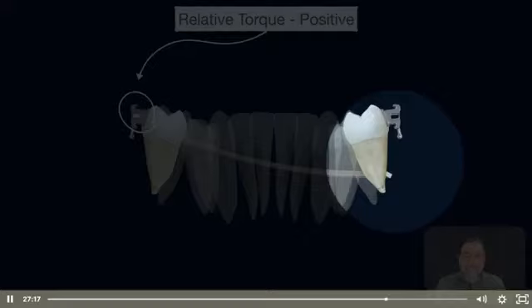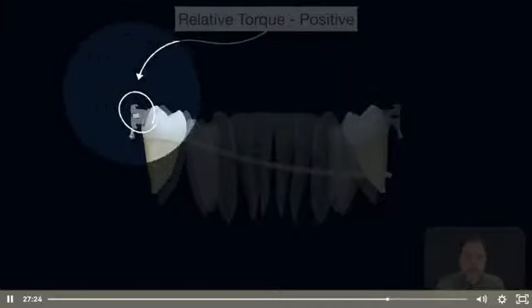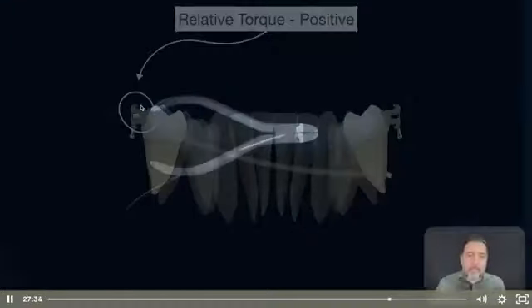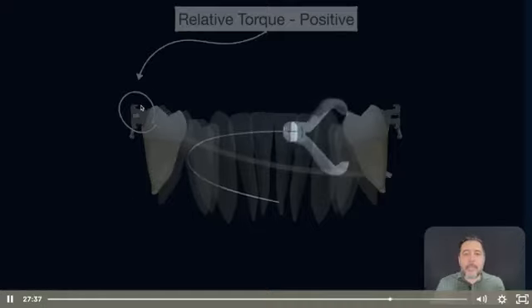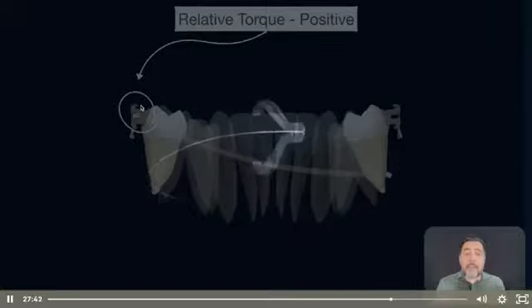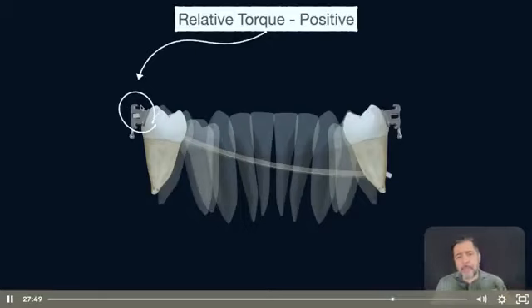Here it is. It goes down this way. So when I go up to insert inside the tube, this side here will be torqued, and the torsion that we gave here will apply a couple. Let's see this couple. So this is the way we assess the torque, and when we do that, we consider this a positive real torque to the posterior segment. And the relative torque will be what? I'm referring to the relative torque because it is important for you to understand this relationship now.